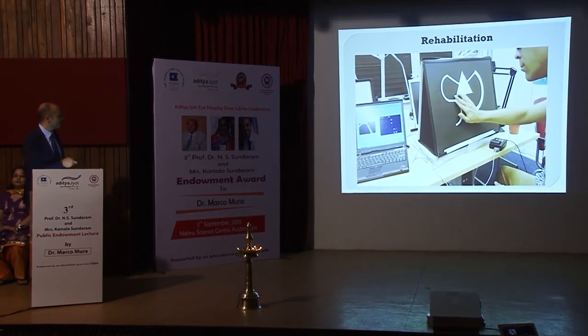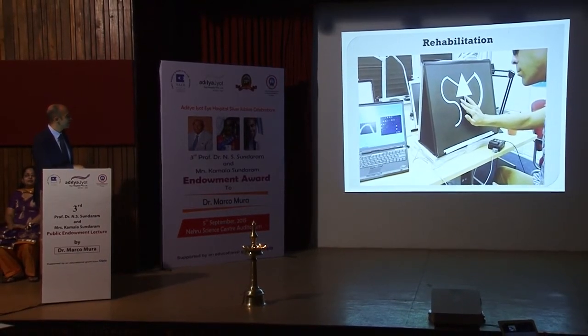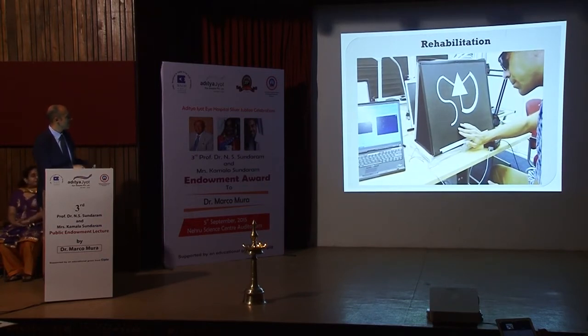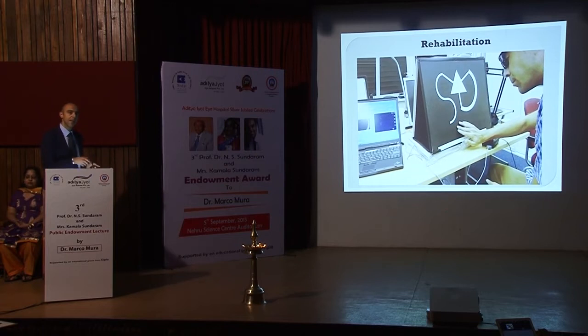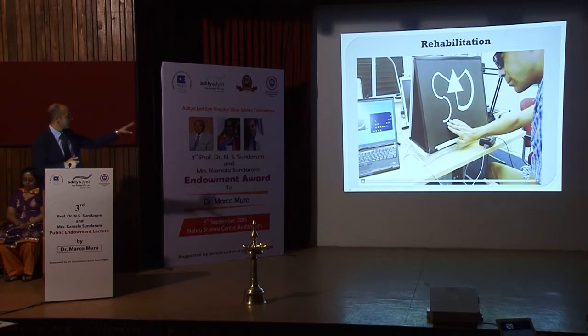In this case, for example, our patient is being asked to follow the line on this magnetic board and try to find the end of the line. What you see here on the computer is that it is connected to the computer of the patient, and we can see in real time what the camera sees and what is projected into the electrode array. This is the electrode array, this is the image in the camera. Using this system, we can guide the patient and teach them how to regain the coordination between the camera and the fingers and the hands. And this is really important to grab objects. You have to get this system back. You can see the patient can touch the end of the line perfectly.